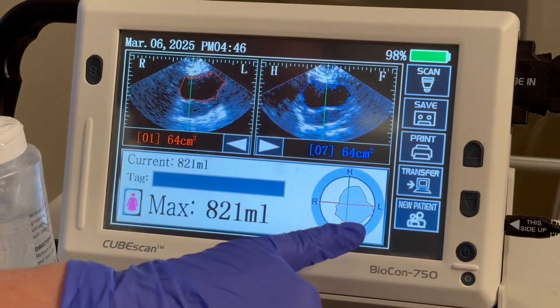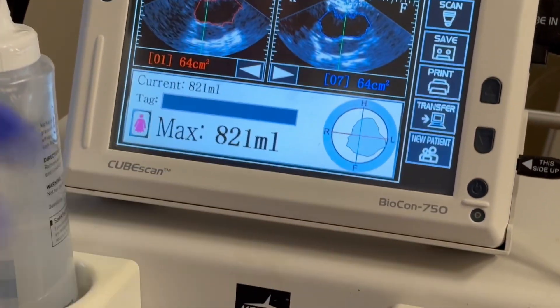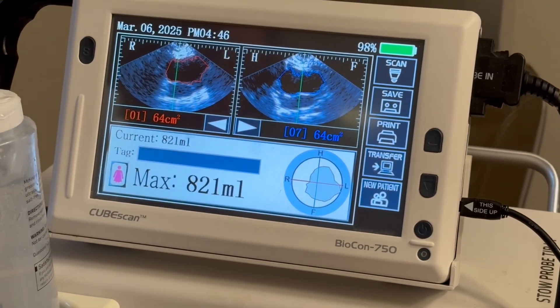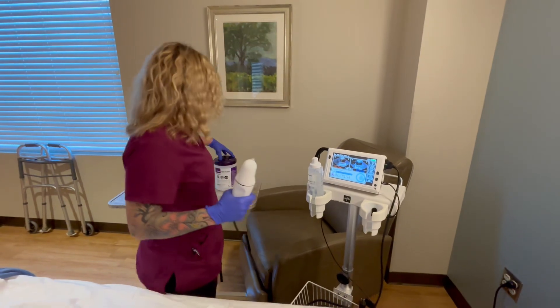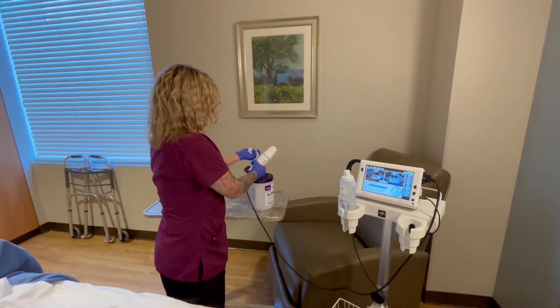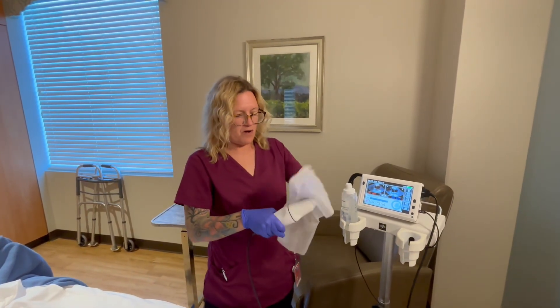If you look at this circle here and the bladder is in all four corners — at least touching the corners — you have an accurate result. It's saying 821 mils is what's in her bladder, so I'm gonna document that after she went to the bathroom, or whatever the situation is for why you're doing it.